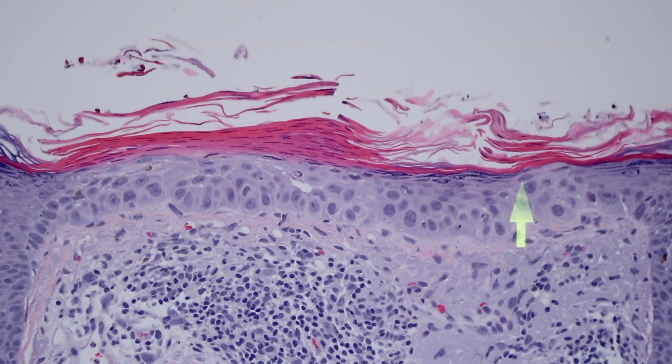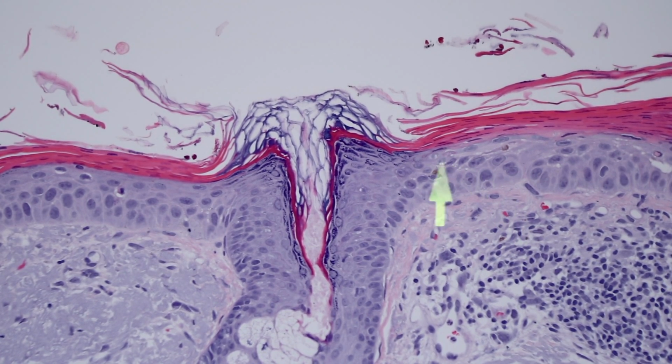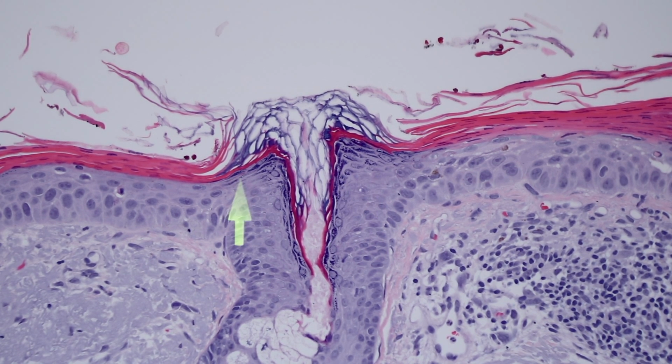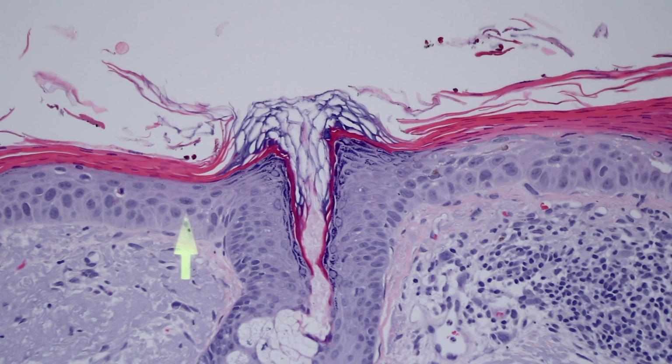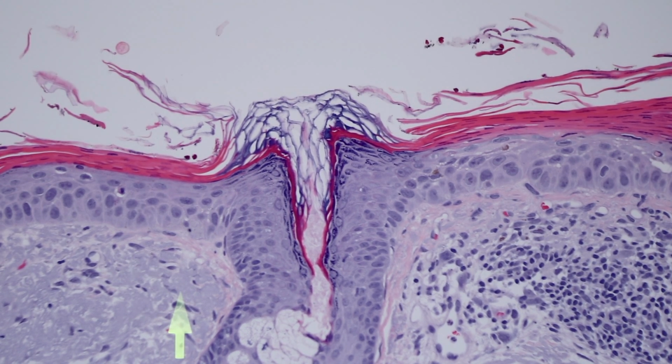So I think that this is a really nice example of actinic keratosis here. And AKs, AK is our abbreviation for actinic keratosis, AKs tend to spare the adnexal openings. So the hair follicle openings and acrosyringia, the openings of the sweat ducts, usually have normal looking keratinocytes around them and a relatively normal corneal layer over top. You see the parakeratosis stops right here, the atypia stops here, then you have normal, and then you're back to the actinic keratosis. So that sparing of the adnexal openings is a feature that we often see in actinic keratosis.